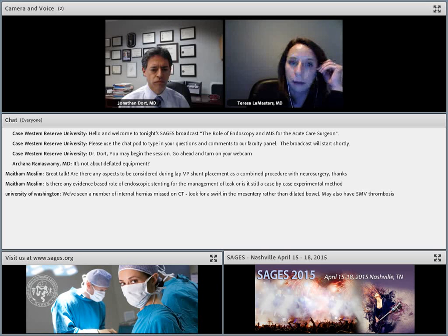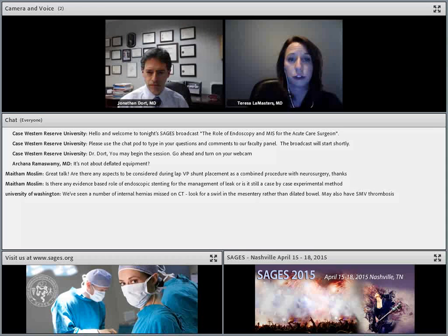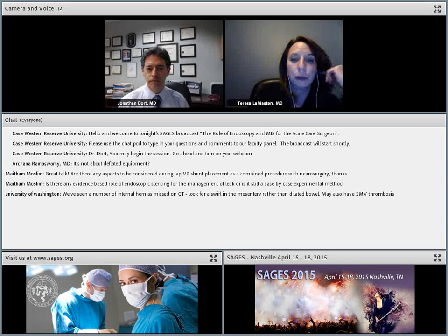So it can be used. It's usually used to cover the leak and be able to feed the patient. The problem is they're not well tolerated. Patients have a lot of nausea, epigastric pain, vomiting, and the stents tend to migrate. So we talk a lot about stents, but we don't use a lot of stents. A lot of times, if you can get good drainage and make sure there's not a distal stenosis, a lot of these can heal without a stent. But stents can be useful in some cases. I just would say they're not the panacea we had hoped they would be.